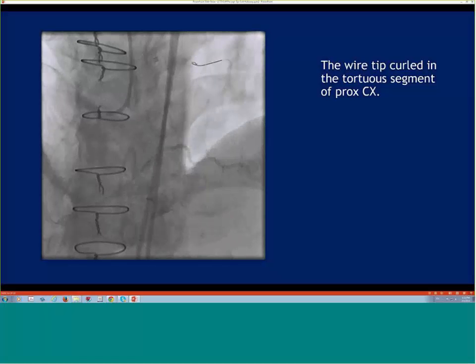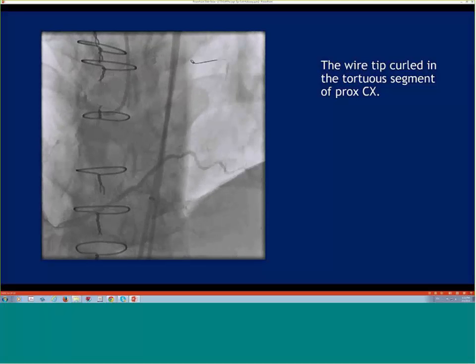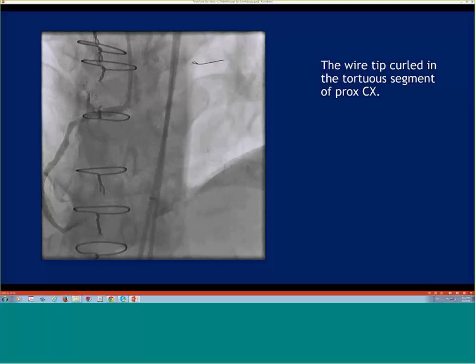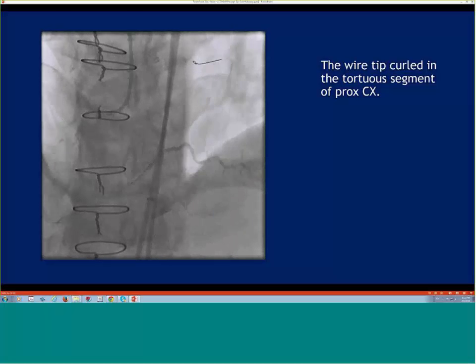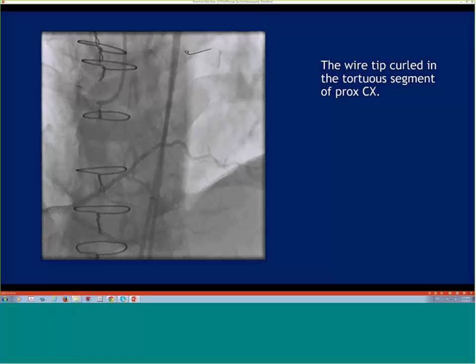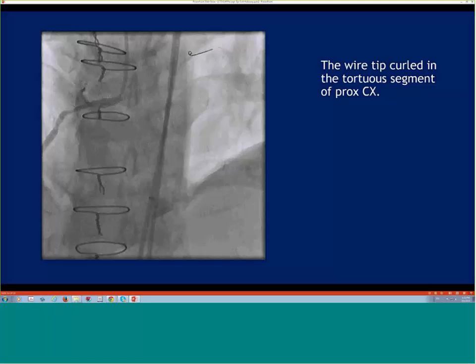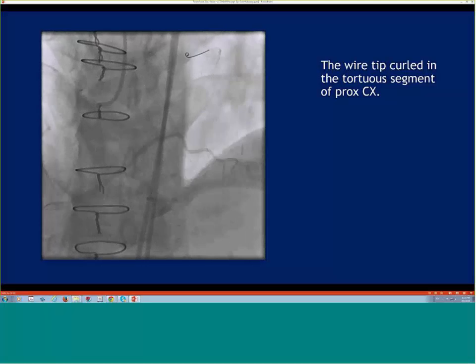I would actually first do an antegrade attempt this time. You have a very good landing zone, and do an IVUS just to confirm where the origin of the circ is, to be 100% sure. If you see the origin of the circ is very, very close to where this wire could be, maybe just sticking with a Venture might be a good initial approach. Try antegrade first. If it doesn't work, then do the same thing you did now, but with an 8 French AL1 with maybe a GuideLiner, getting good support. But I would still try antegrade first, given the complexities involved here.